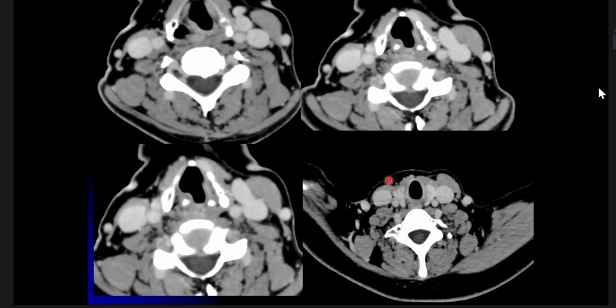What you would like to do when patient comes with the hoarseness of voice, you are seeing in the CT images, where you will try to see the lesion now? That means vagus nerve and spinal accessory nerve has been involved. Okay, perfect. So in one patient, two nerves are involved. What is the probability of the lesion being where? Somewhere higher up in the base of the skull.